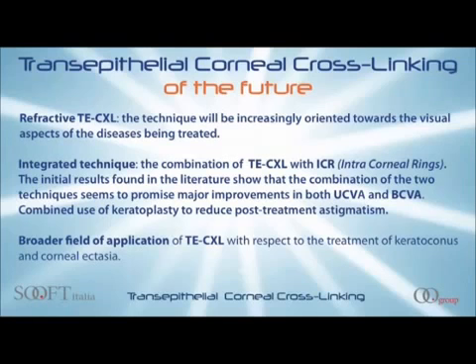Combined use of keratoplasty to reduce post-treatment astigmatism. Broader field of application of transepithelial cross-linking with respect to the treatment of keratoconus and corneal ectasia.